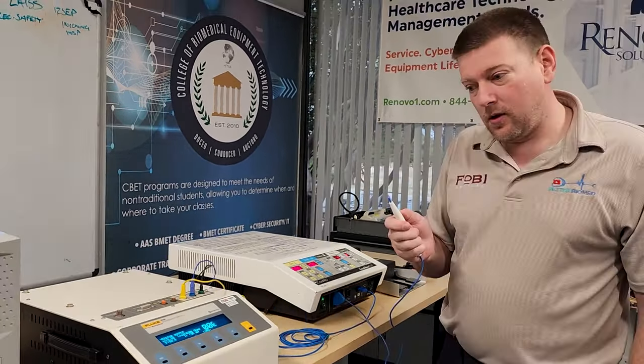This machine I believe will never be put back into service — it's discontinued and no longer supported — but they want to verify it's functioning correctly for legal reasons. All these output readings will be written down and compiled into a report. One of the last checks is RF leakage. Let me go ahead and hook it up for RF leakage testing.